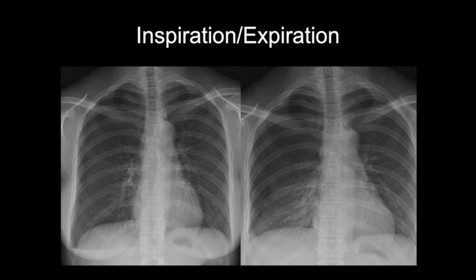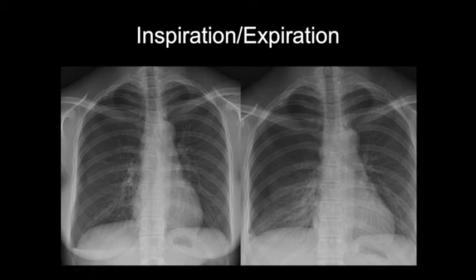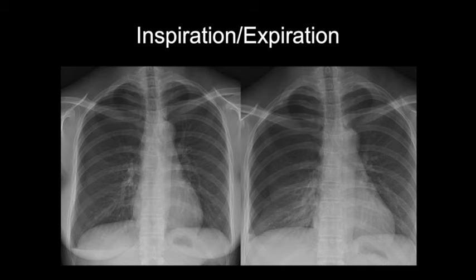When you're imaging a pneumothorax — air in the pleural space — you can do expiratory views to make the pneumothoraces look bigger and more obvious. On the left here we have a normal inspiratory view, and there's a pneumothorax on the right. You have air between the visceral pleura that outlines the lung and the parietal pleura on the chest wall. To diagnose a pneumothorax, you need to see a pleural line and absent lung markings distal or peripheral to that pleural line.